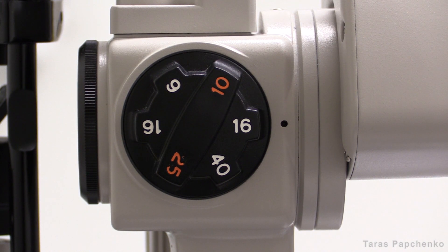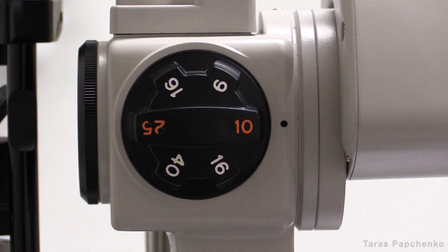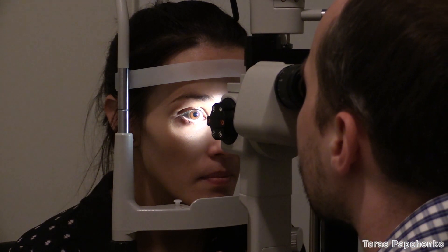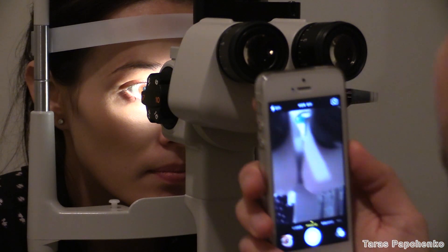By and large, I use 10x magnification for most of my shots. Have a look through the eyepieces to make sure your view is in focus. Now you need to get an image on the phone.